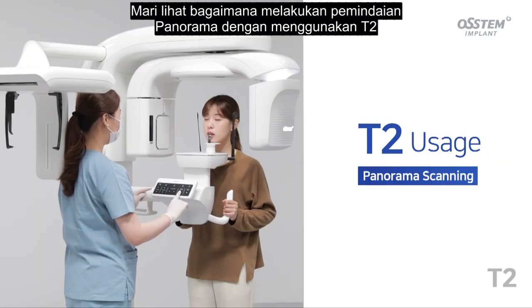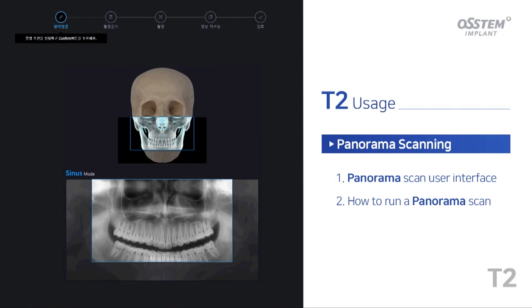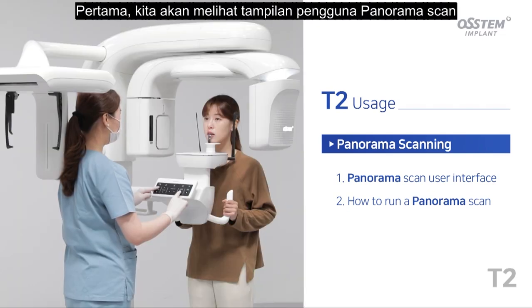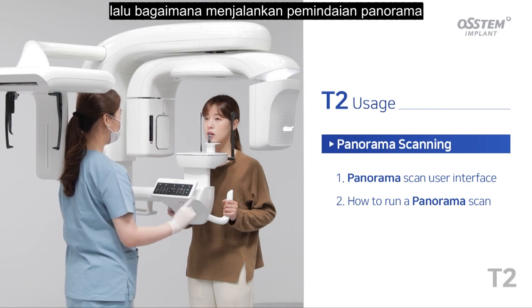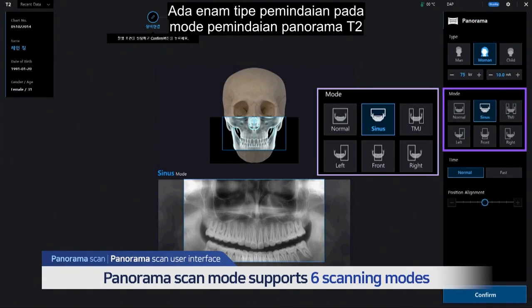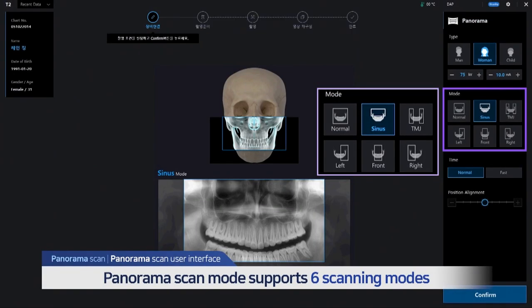Let's take a look at how to run a panorama scan using the T2. First, we'll be looking at the panorama scan user interface, then how to run a panorama scan. First, let's look at the panorama scan user interface. The panorama scanning mode of the T2 supports 6 types of scanning.